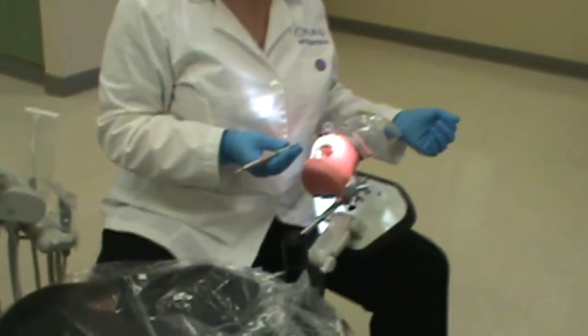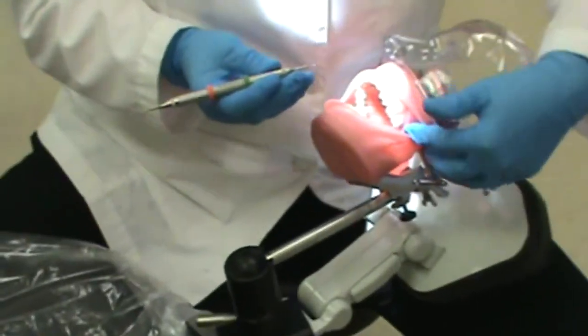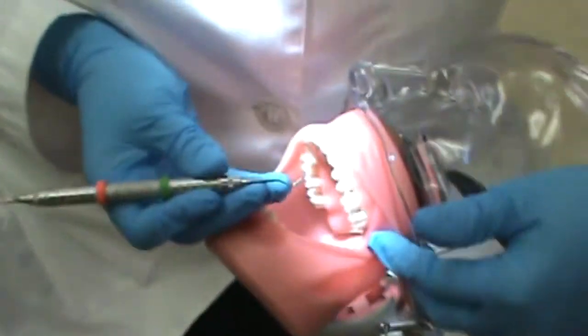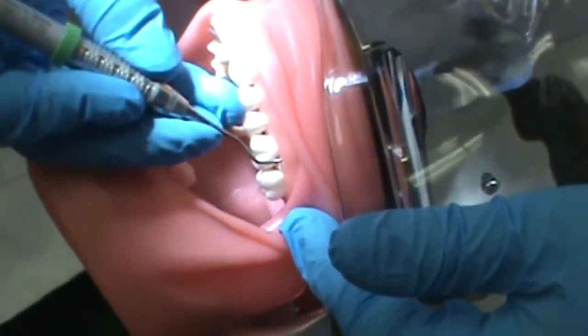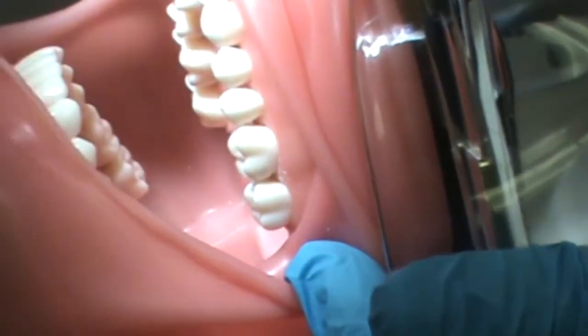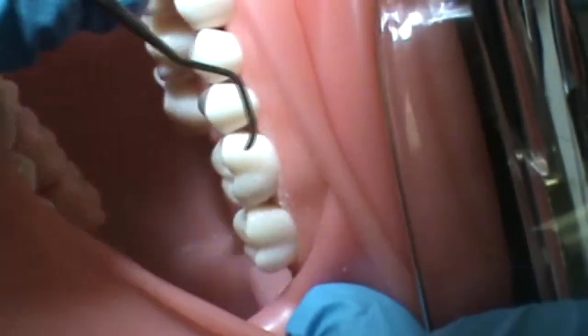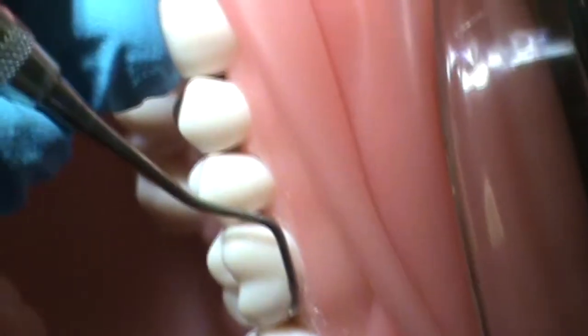She'll begin by selecting the correct working end of her instrument. This will be seen when the lower shank is parallel to the distal surface and the functional shank is going up and over the tooth. Incorrect positioning would be seen if the functional shank was down and around the tooth and the lower shank was not parallel to the distal surface.